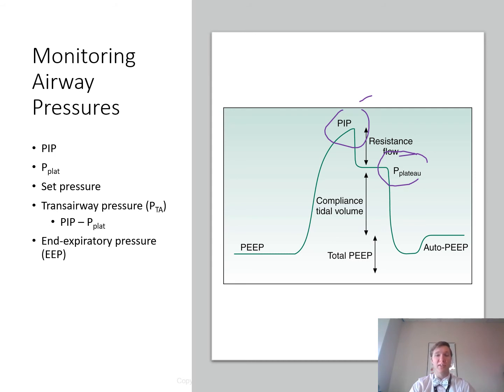All right, let's go to the third bullet point here, the set pressure. During pressure control CMV, pressure control IMV, pressure support ventilation, you will set a target pressure to be delivered to the patient. So this usually includes a separate piece on the ventilator flow sheet for entering that target pressure that you'll only use when you have pressure targeted modes. So that's something that you'll set there.